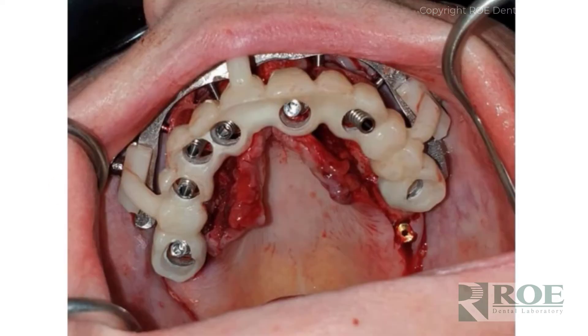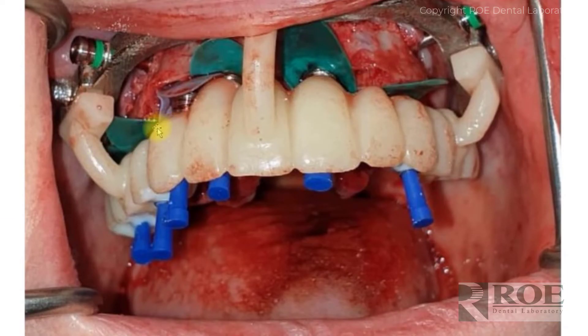If at this point the case is not seating fully into the arms and into the Chrome locks, you need to ask what is holding it up. More than likely it's bone — it could be a little tissue, but mostly bone. You can use the prosthetic or the rapid appliance, and just keep adjusting bone until it is passive and seats. In this case the doctor used our block-out gaskets — one, two, three, four — blocking out the multi-unit abutments. You sleeve these over the temporary cylinder and then place the prosthetic.